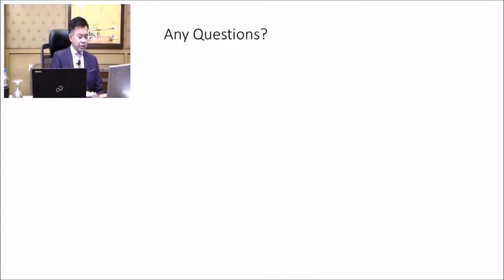Would you recommend Symphony for clear lens extraction if the patient is not a suitable candidate for LASIK? Well, all the patients that I presented today were clear lens extraction patients, so yes, I think I would. In the case of controlled glaucoma, is Symphony advisable? We have implanted Symphony lenses in patients with glaucoma.